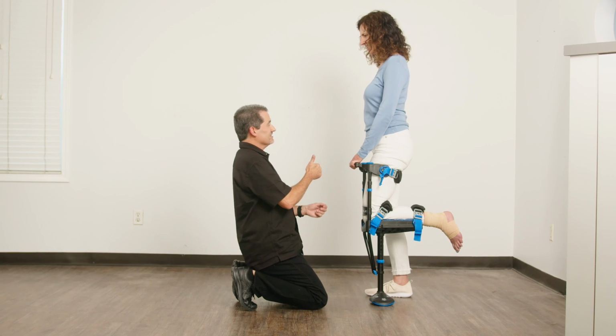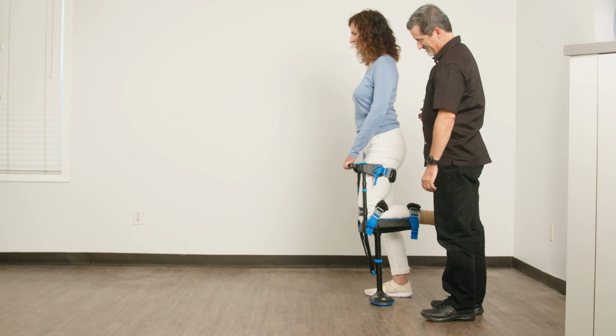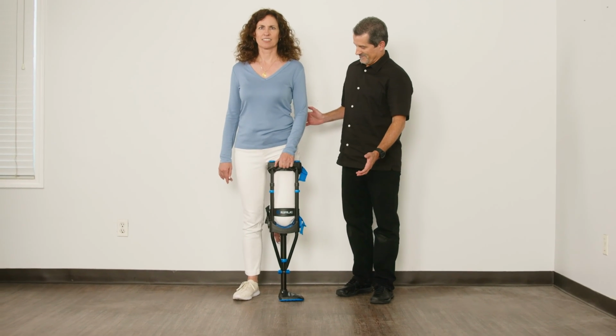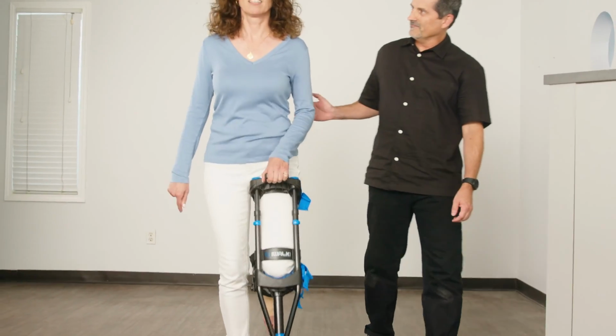Walking. When they have mastered these drills, it's time to let them walk. Position yourself beside and slightly behind the patient on the crutch side. Patient starts the same way they started the exercises. The first step is with their good leg, but this time they will continue walking. Once they start walking, don't stop. Continue for as many consecutive steps as space allows.